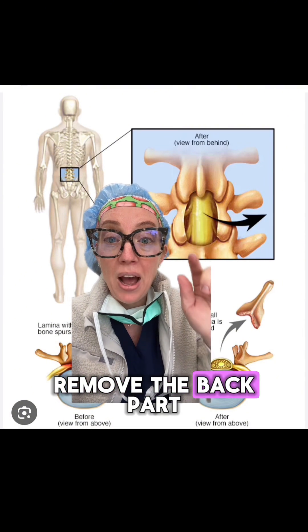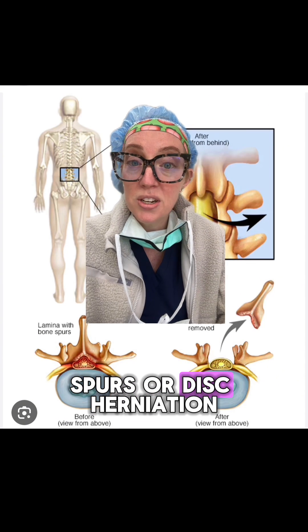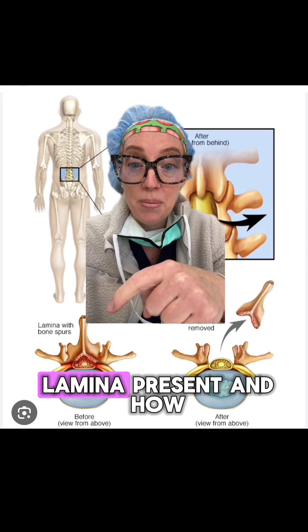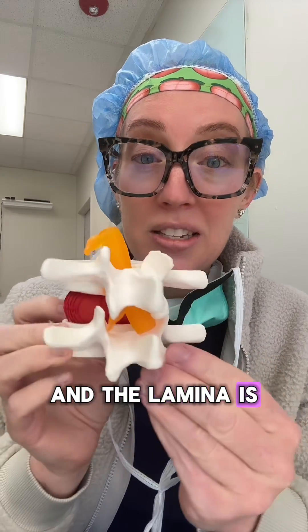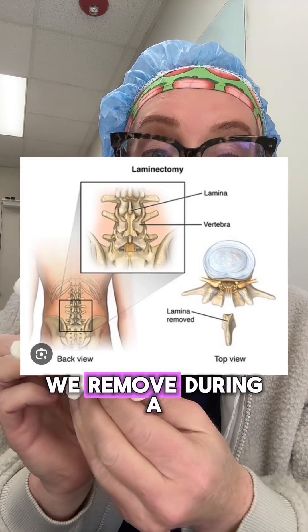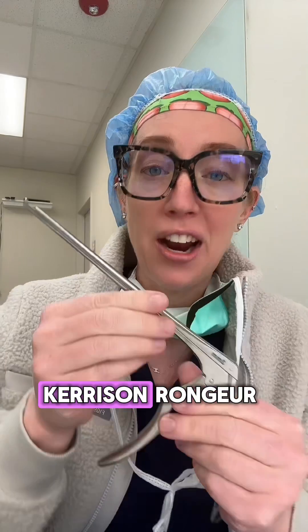We remove the back part of the bone called the lamina. That's done so we can remove any bone spurs or disc herniations that are pressing on the nerves. Here you can see the lamina present and how it looks after we remove it. This is a model of a spine, and the lamina is the very back part of bone right here, and this is what we remove during a laminectomy or discectomy procedure.